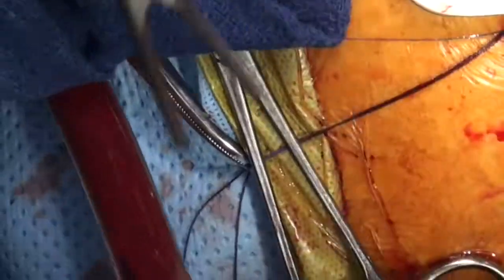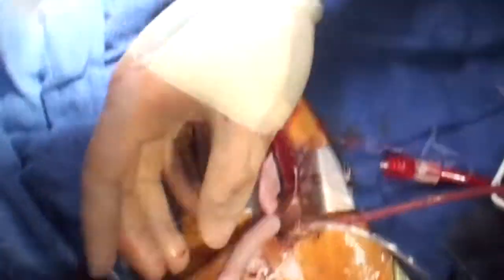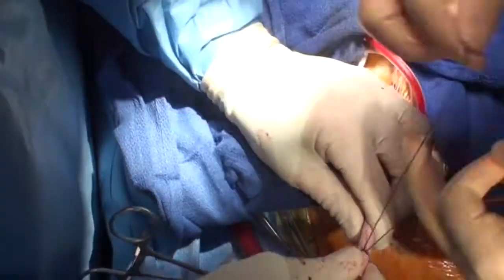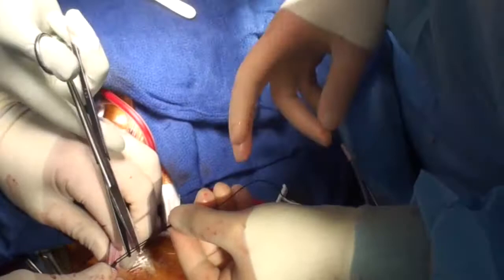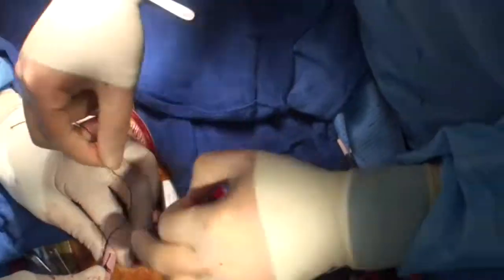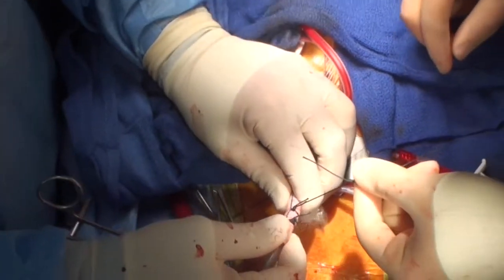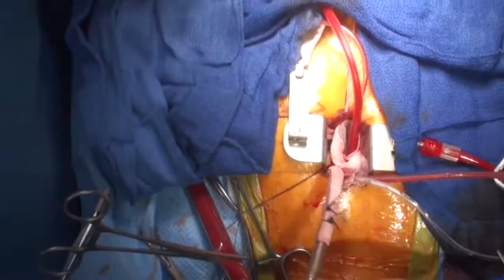We're now placing the aortic cannula back into the sidearm so that we can reinstitute cardiopulmonary bypass. We fix this twice with a silk suture. These will obviously be removed towards the end.